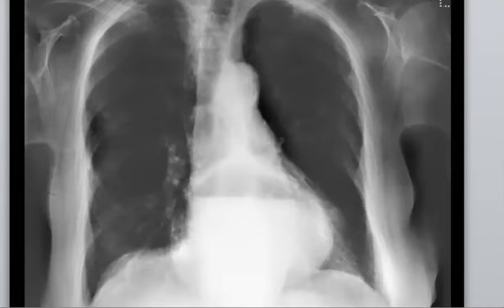So you should mention that there is no free air clearly, okay? Don't waste your time mentioning incidental findings which are not related to the disease. Mention it if it is related, but don't waste your time. Also, try to mention the differential if it is typing.